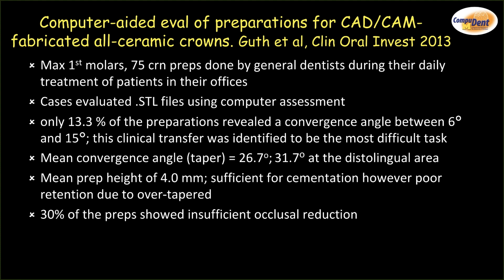So we know that even if we're not trying to work on a short clinical crown prep, studies like this show us that the challenge we have in the preparation to be retentive are the 2 most important pieces we have to get right: the taper and the clinical crown height.